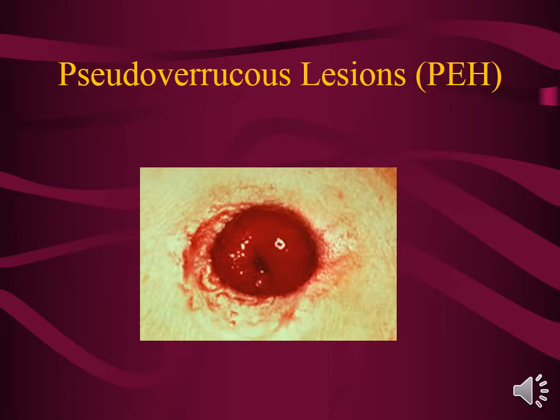The other thing I would mention is if you ever have to get a urine sample from a urostomy, you are not to take it from the pouch, but you are to use a straight catheter kit and take it from the stoma. If you take it from the pouch, you will get a UTI every time from the urine that you've got, because it's contaminated urine, so it does need to actually be taken with a straight catheter.